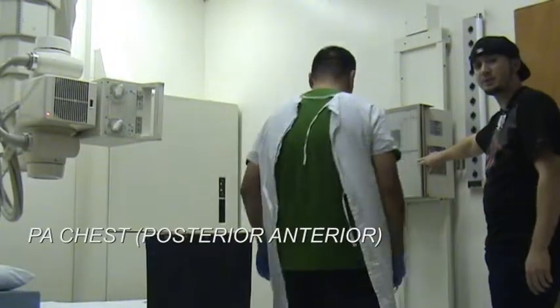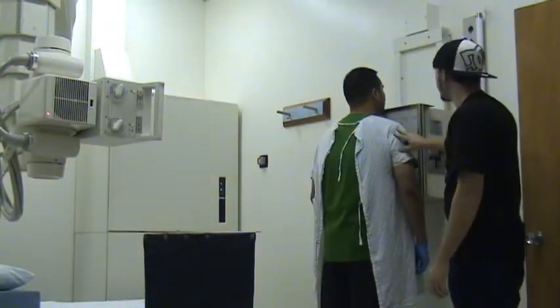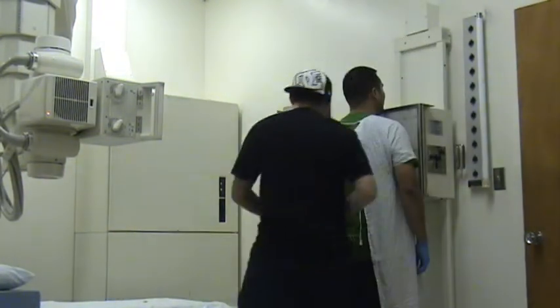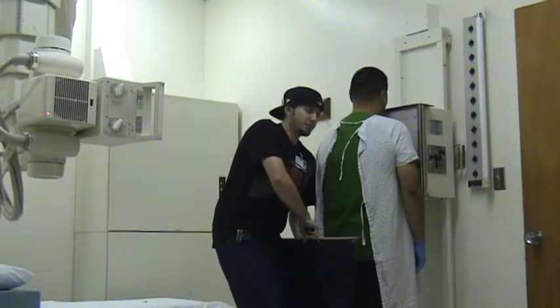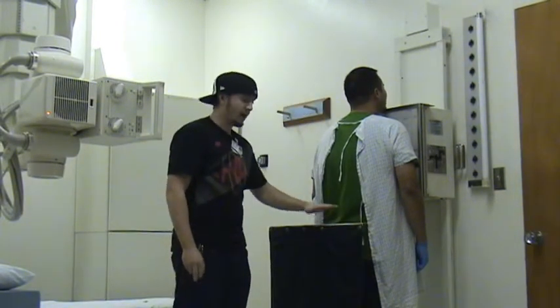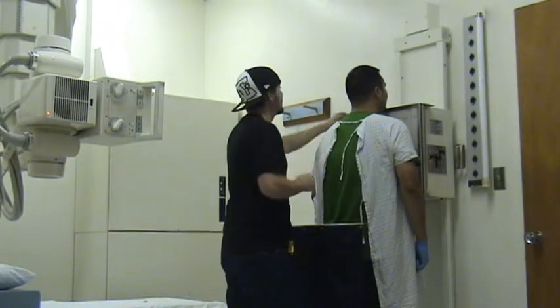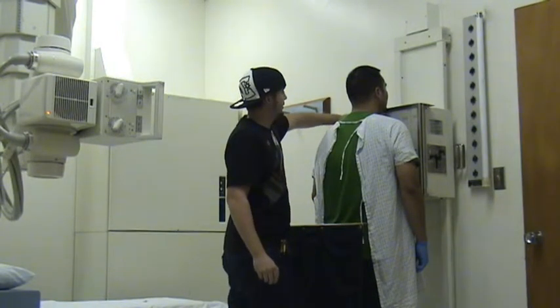So we're going to be doing a PA chest. You want to make sure that you bring the patient up to the bucky here. And we're going to shield the gonad area, since this is a male, and even for females, you want to make sure you don't shoot the ovaries. Adjust the shield according to height. Alright, sir, we're going to put you up against this board here. We put the left marker on the left side of the patient to represent the anatomy.